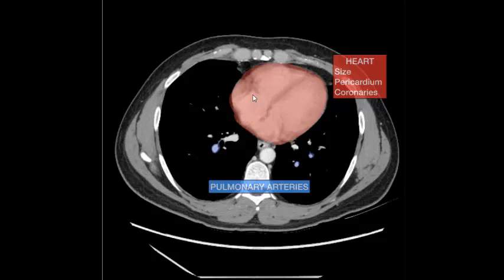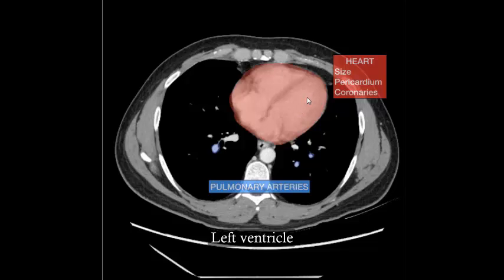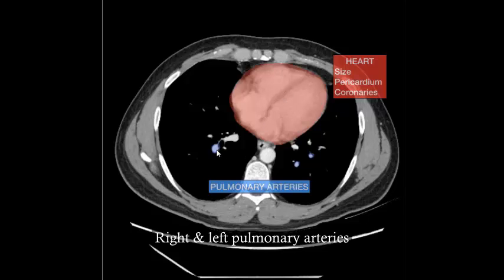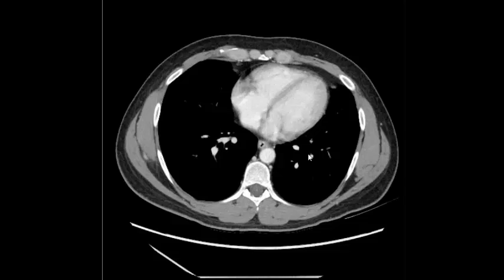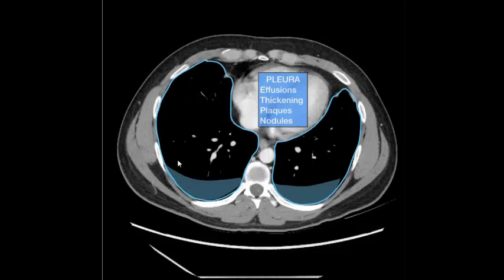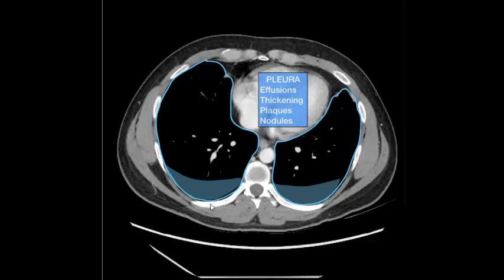Right atrium, left atrium, right ventricle, left ventricle, interventricular septum, right and left pulmonary arteries, right and left lung, bilateral pleural effusion.